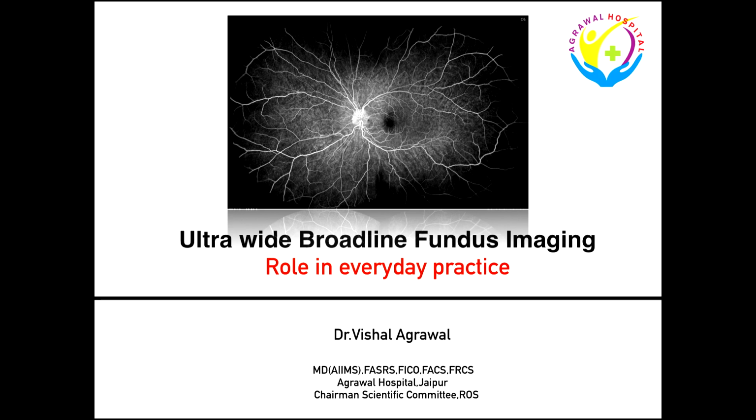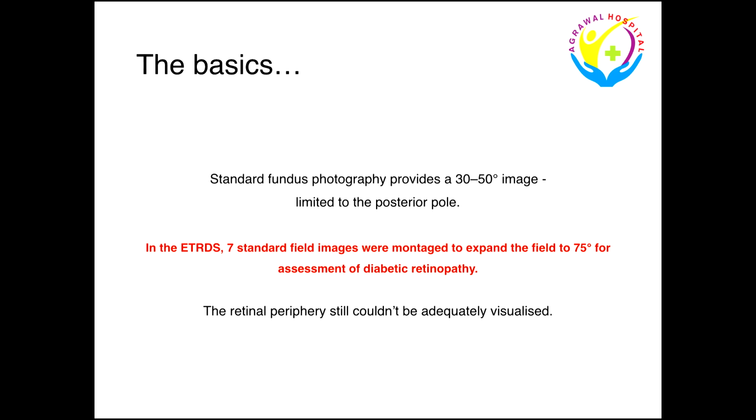Thank you, everybody, and good morning. I'll be speaking on the role of ultra-wide imaging in everyday practice, and specifically, I'll be using my experience in this presentation of the broadline fundus imaging, which I use regularly. So just brief about the basics.